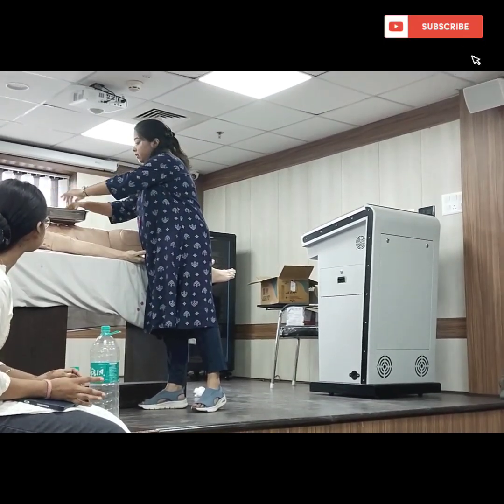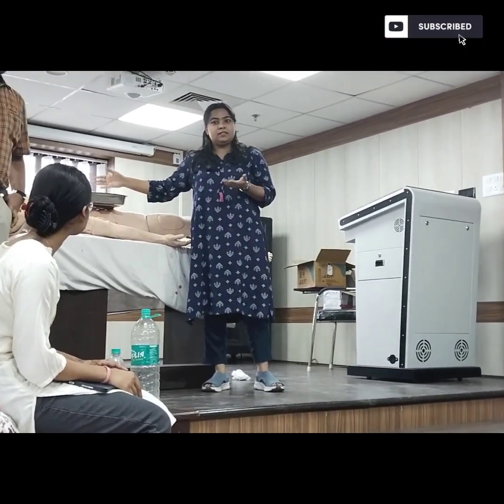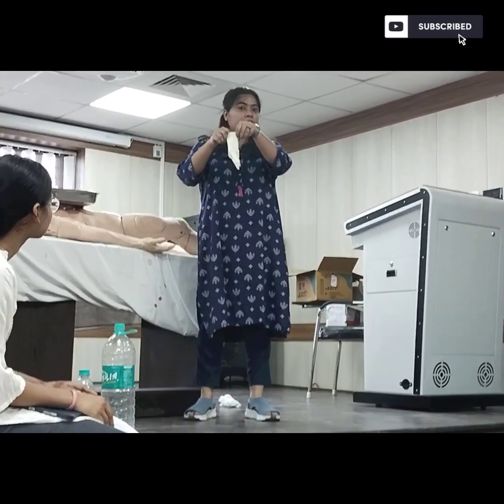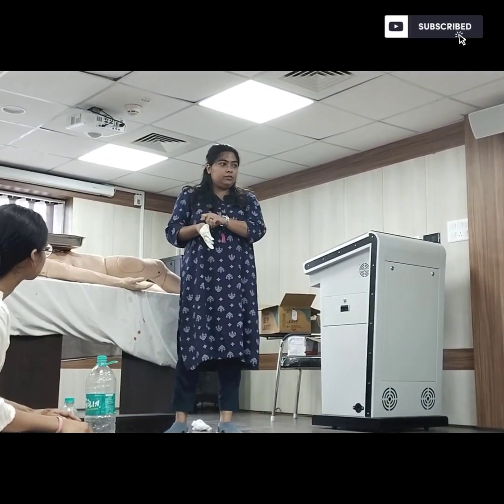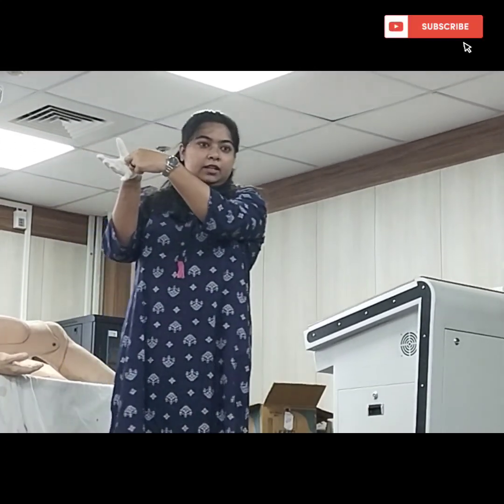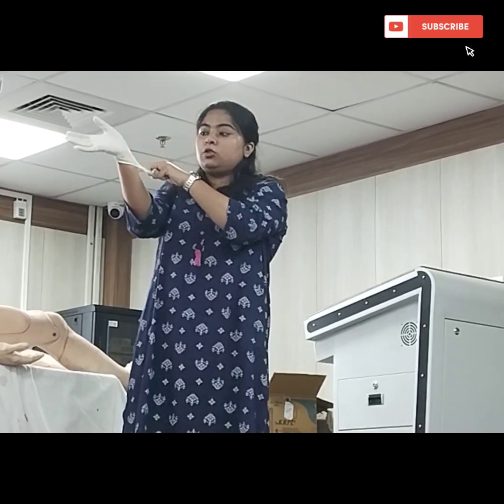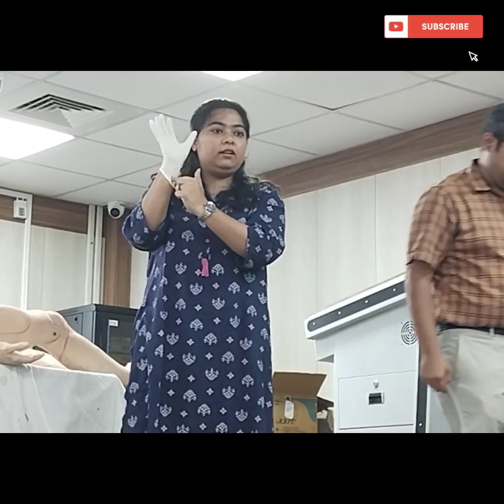You will open it, and then it is written over the paper which one is right, which one is left. So you will first take the gloves, and first what you have to do is manipulate your thumb first. After you put your thumb inside the gloves, then you manipulate the other fingers, and then this part of the gloves that should be on the outer side, only touch this part, so that you can draw up to here. So that up to here the glove is sterile.